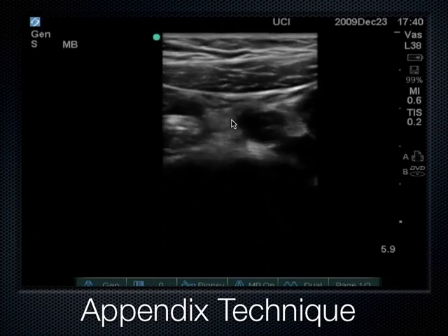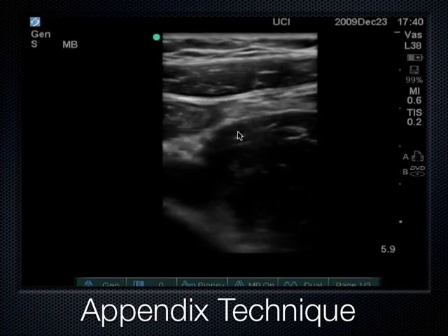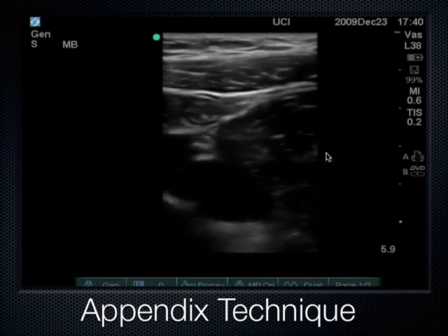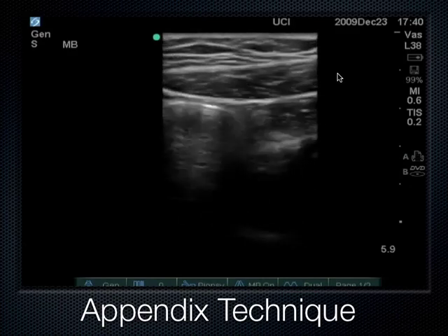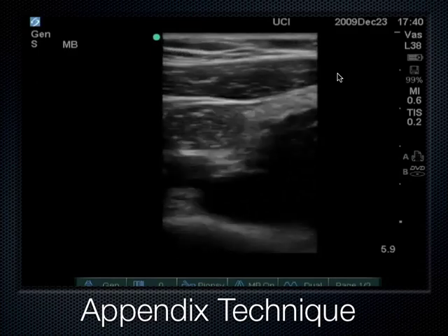So how do you do this? It's called the graded compression technique, and what you're going to do is, after you adequately arrange for the patient to have analgesia, you go in and you compress. This is the psoas muscle right here, and it's going to come in contact with the abdominal wall musculature. As much as I can describe this to you in a lecture, this is something that you really need stick time to get a good beat on. And we're going to be practicing that today.